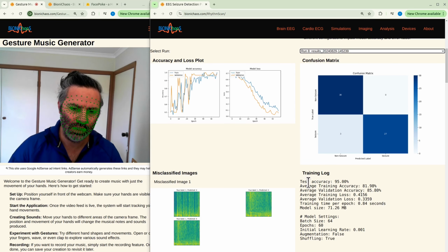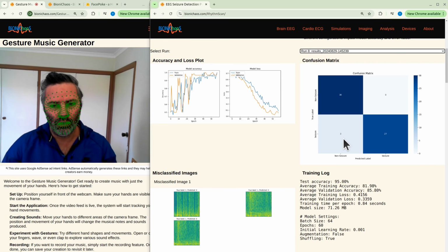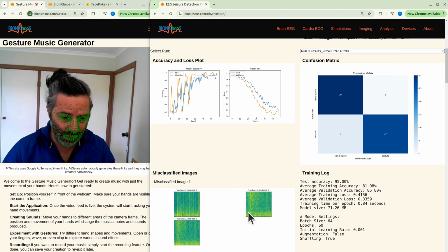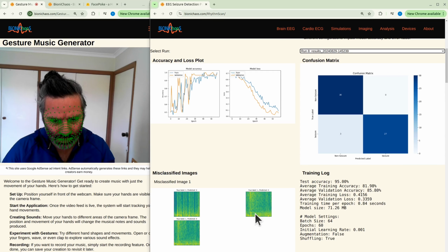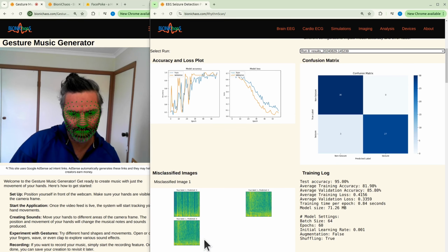We get up to a test accuracy of 95 and no false alarms, which is great, and only 3 false negatives, so 3 misses. And yes, you can see from the misclassified images that it's actually hard, except this one. I would have expected the model to get the second image correctly, because you can see something in there. The first has a lot of noise in it, so it's not surprising that we got it wrong. And the third one, you can't see much in it.